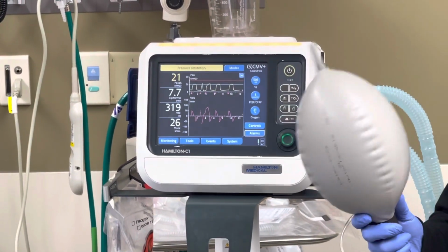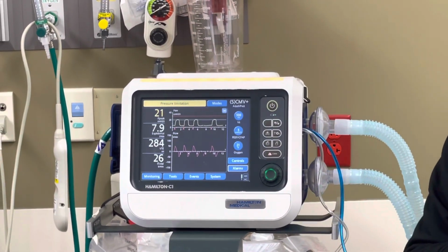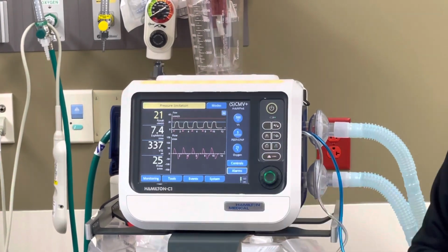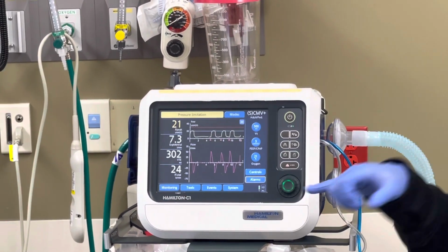Especially when you have a patient when you're doing everything, it's not going to alarm as much. But when you have a patient that is breathing and going against the vent, it's going to start to fight with it. And once it starts to fight with it, the vent's going to start cutting off the patient's breath.